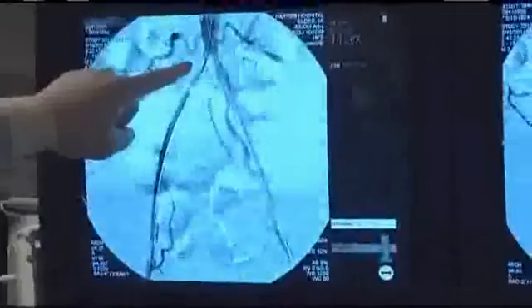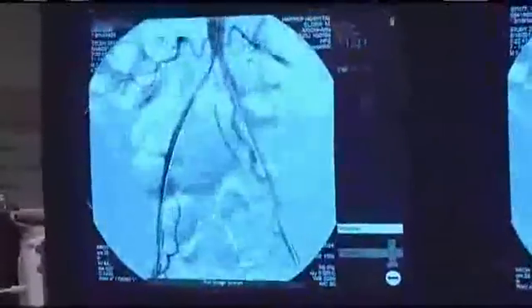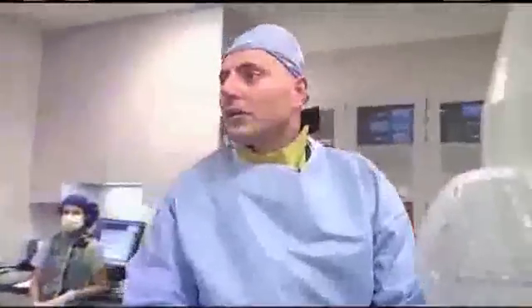We also see that there is a nice patent lumen after opening the chronic total occlusion, and we see some residual, perhaps a little bit of thrombus, in the distal external iliac. Restructuring of the carina, so we're going to freeze this and place our stent. We're placing one stent at a time, starting with our shorter stent. Now we're placing our long stent in the chronic total occlusion.